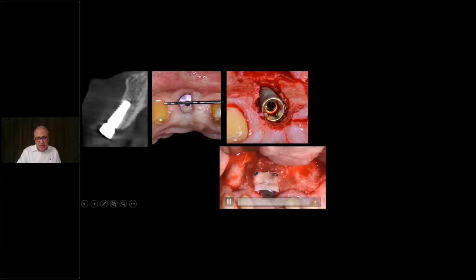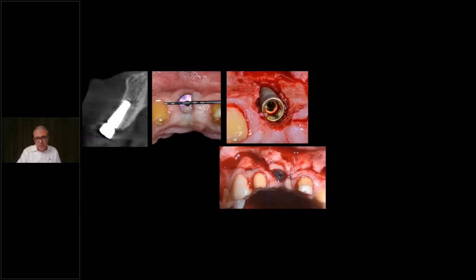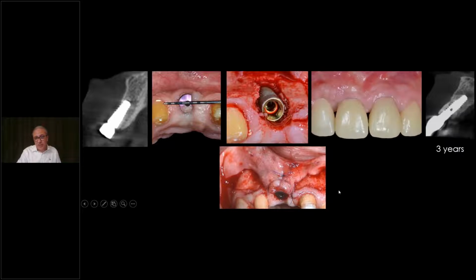For those who are interested in this type of graft, you can check out the special chapter in my book for it. And here's the case followed up 3 years later down the road. You can see a better aesthetic outcome with very nice emergence. So once you restore the position, you will end up with a very good aesthetic outcome.